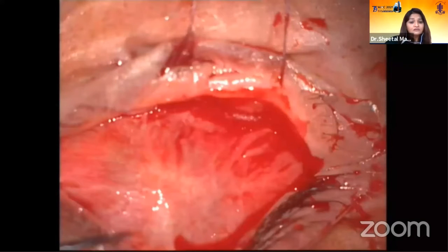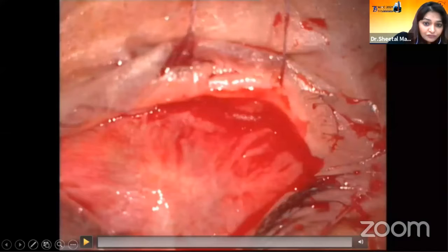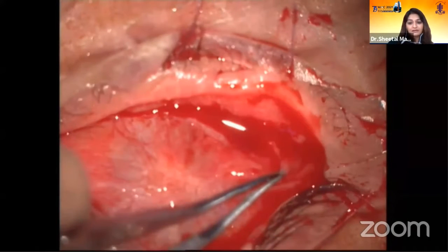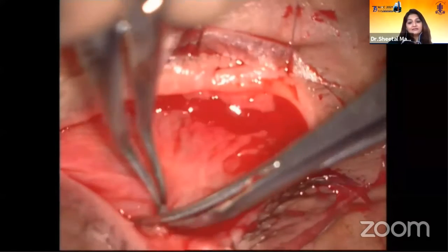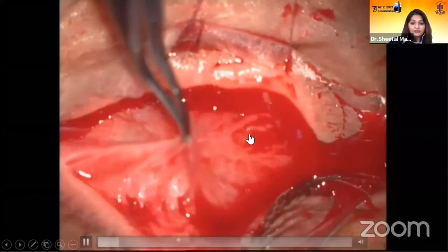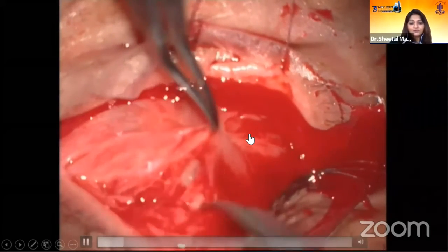Eventually this patient landed up like this. So this is a short video of my case where at this point in time, I thought, let me do the keratoprosthesis under the pannus because I had learned from my last case. I released the inferior symblepharon, and then we started dissecting it from the superior edge.